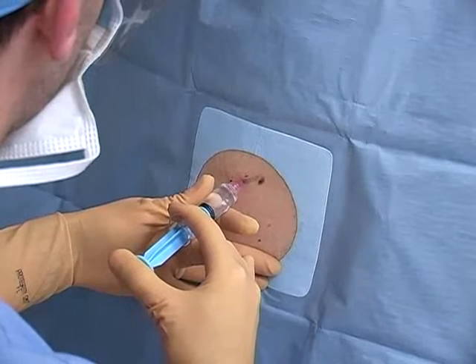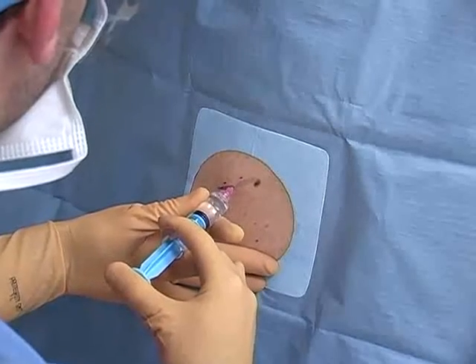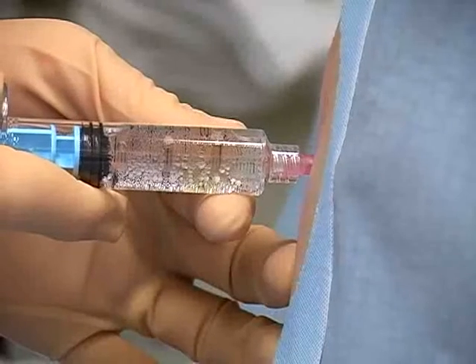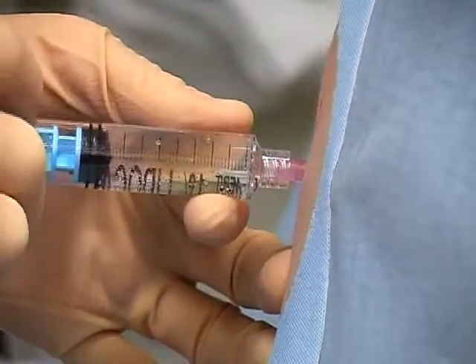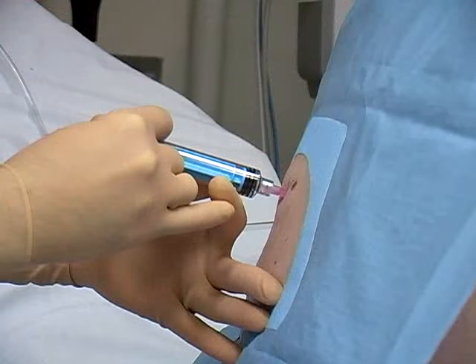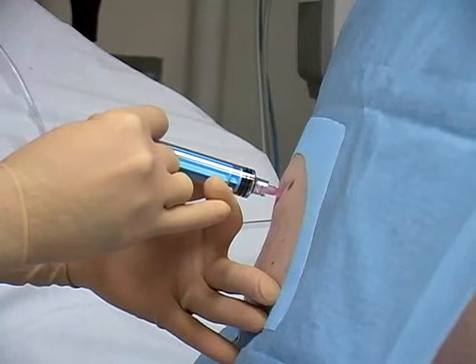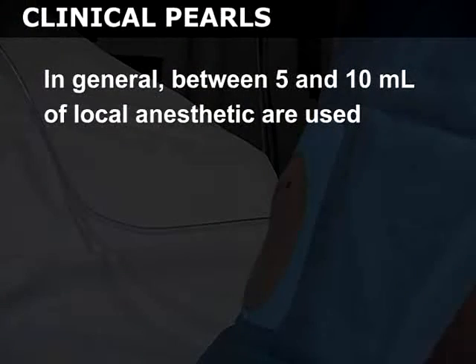Continue to advance the needle, alternately injecting anesthetic and pulling back on the plunger. Pleural fluid will enter the syringe once the thoracic cavity has been entered. Inject additional anesthetic to anesthetize the highly sensitive parietal pleura. Note the depth of penetration and then withdraw the needle from the chest. In general, between 5 and 10 milliliters of local anesthetic are used.